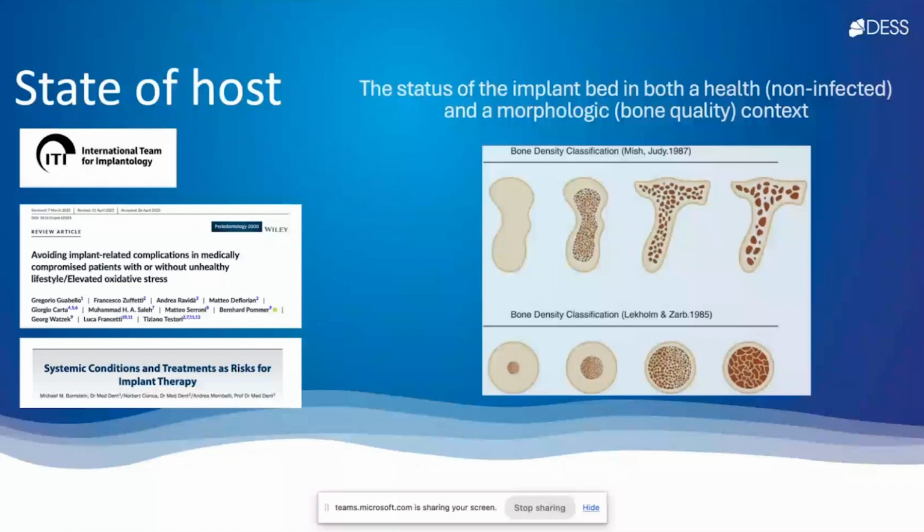For example, when we are dealing with the D4 bone, which is probably present in the upper maxilla area. Nowadays, this is a poor quality area of bone, so we are aiming to condense this bone, not just remove the bone by drilling. We are using densabers, for example, to condense the bone and to enhance the bone quality and the stability.